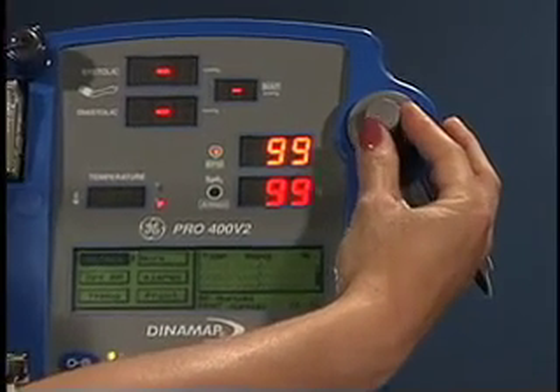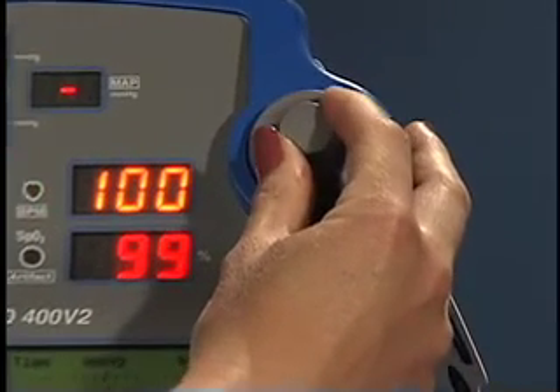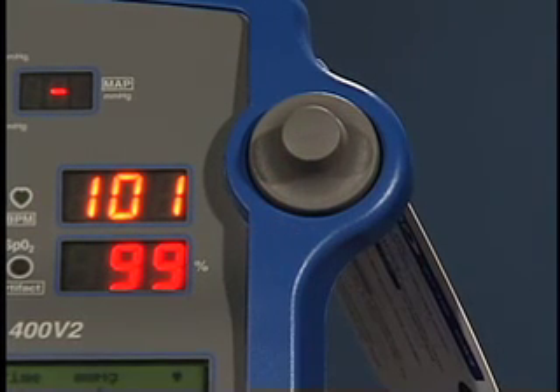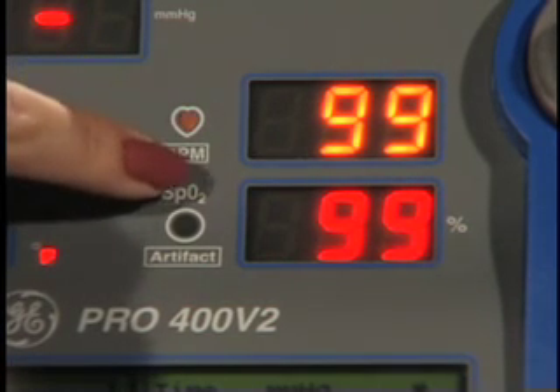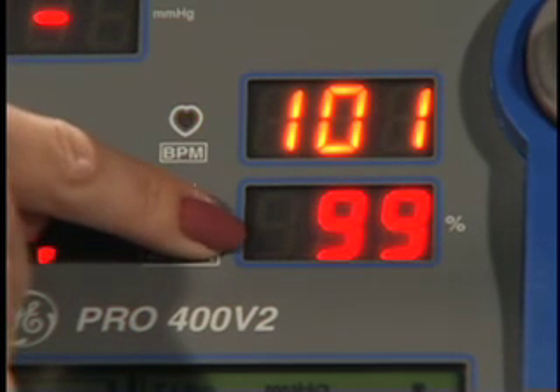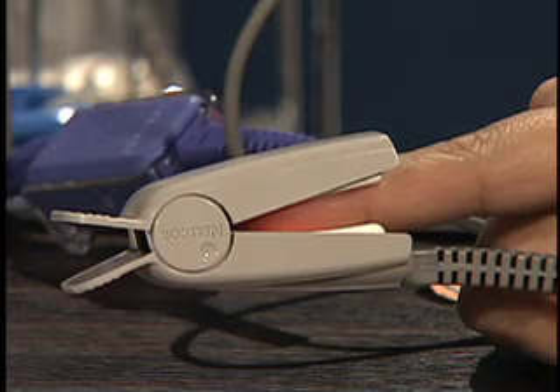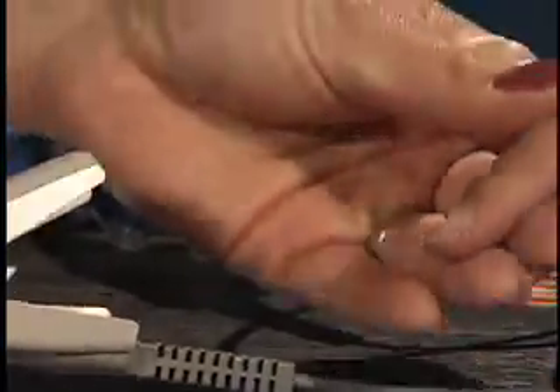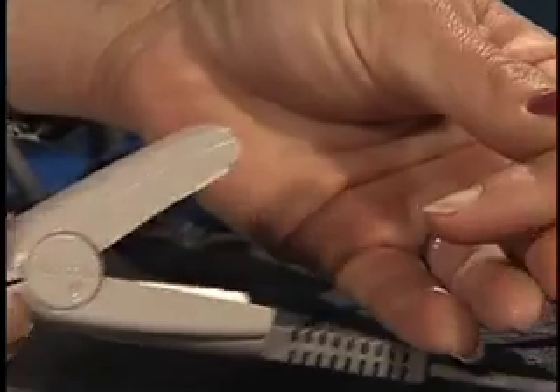Set the alarms on the pulse oximeter according to agency protocol. Check oxygen saturation at regular intervals as ordered by physician and necessitated by alarms. Intermittently, remove the sensor per protocol to assess circulation and skin condition under the sensor. Check the sensor probe site as needed.